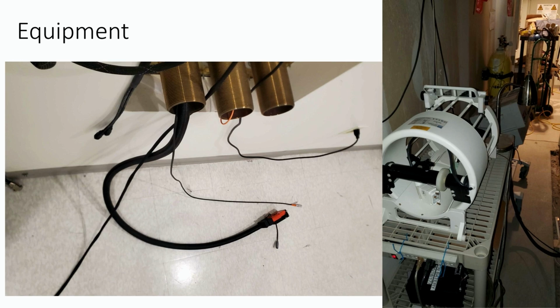As a result, sometimes you run into firing the stimulator at 100% of its output, and it's still not very strong, but the models of safety are built around not filtered and not long cables, and so they don't adjust them for this particular TMS coil, which I think is a shortcoming. As a result, you may be stimulating at a lower intensity than you originally planned with the stimulator turned up at 100%. That's a limitation.